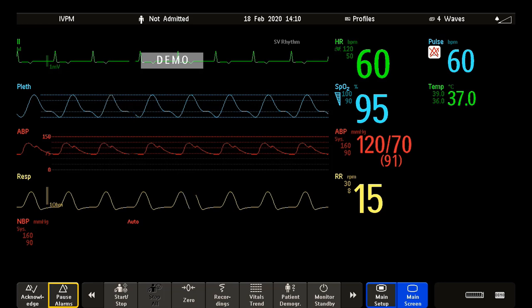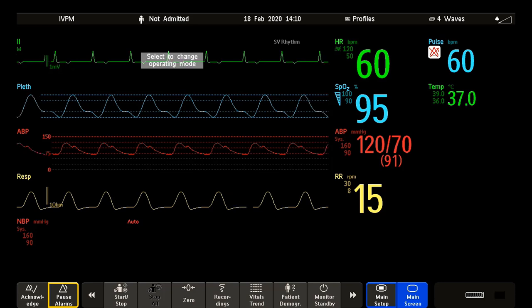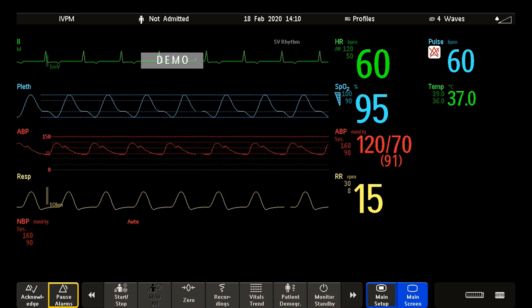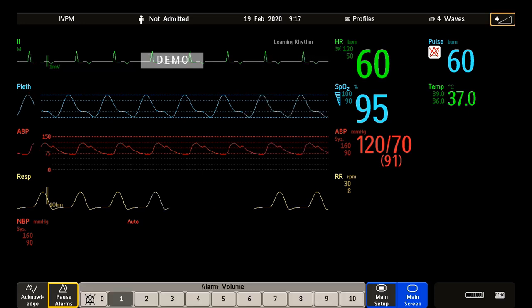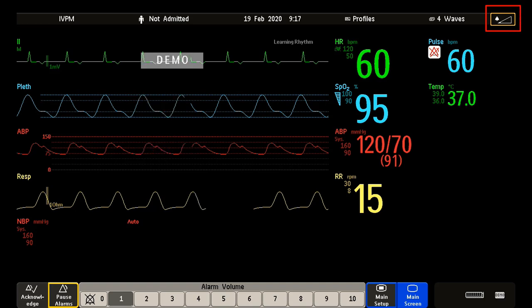The audible alarm indicators of your monitor are configurable, and they depend on which alarm standard applies in your monitor. Here you hear the traditional alarms for the IntelliView patient monitor. You can adjust the alarm tone volume using the symbol at the top right of the screen, or use the alarm volume smart key.